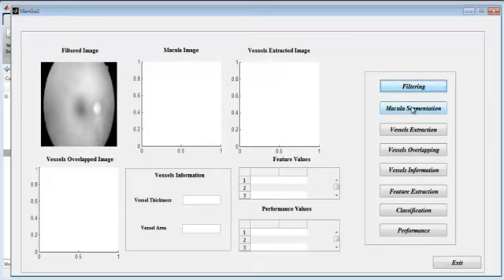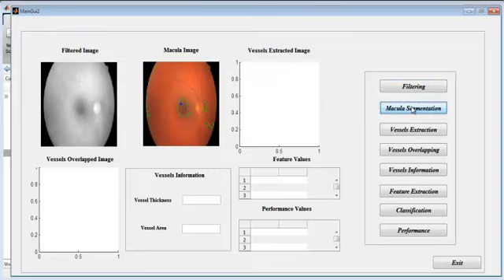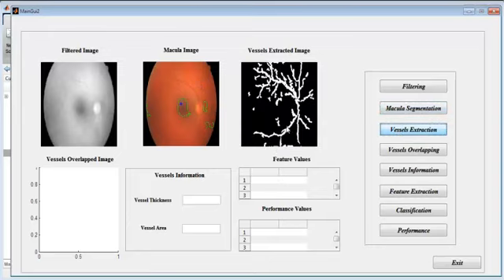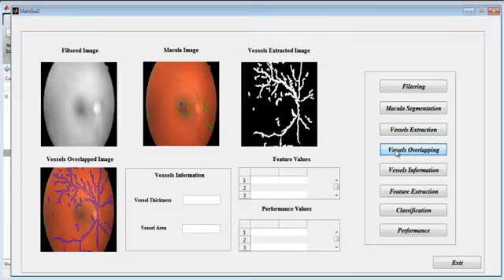Then macular segmentation. Here, segmentation is performed using the Otsu's segmentation model. When you press the macular segmentation button, you will get the macular image. It will represent where the macula is present in the retina. Then vessel extraction — this image shows the vessels that pass through the retina. Then vessels overlapping.